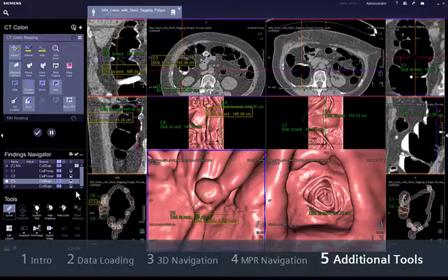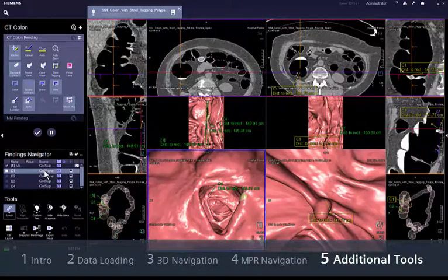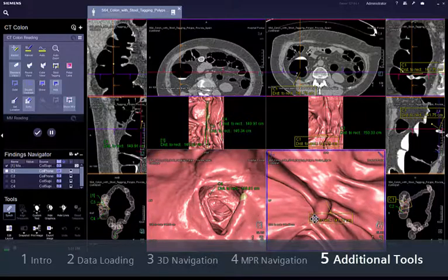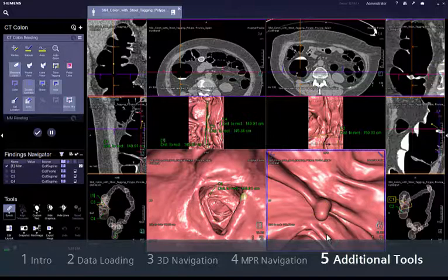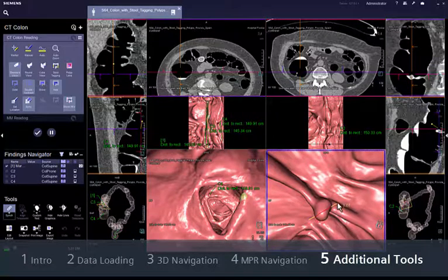To convert a PEV finding into a measurement, click on the finding, then right-click into its annotation box in the endoluminal view and select Start Semi-Automatic Measurement. Now you can measure the polyp size, and the PEV finding is converted into a user finding.